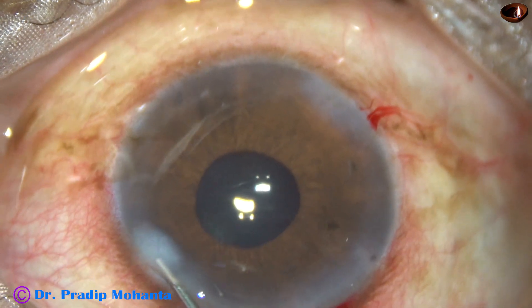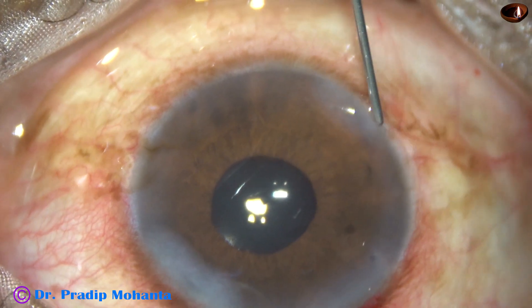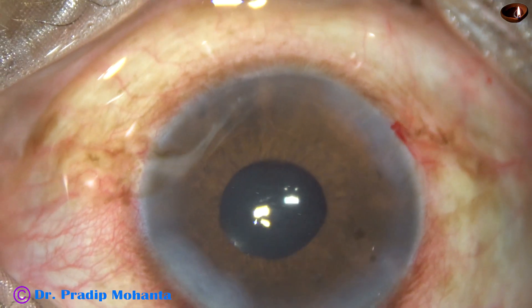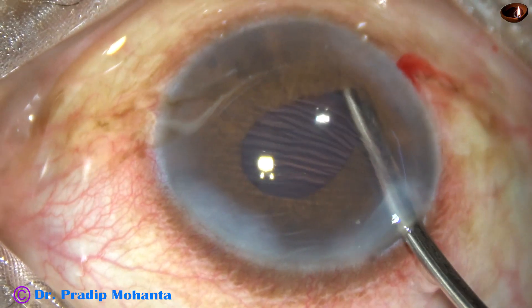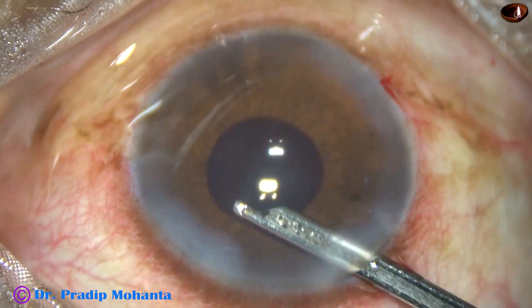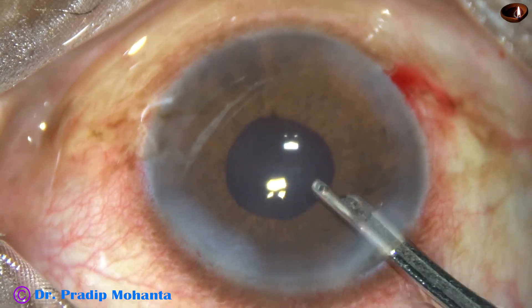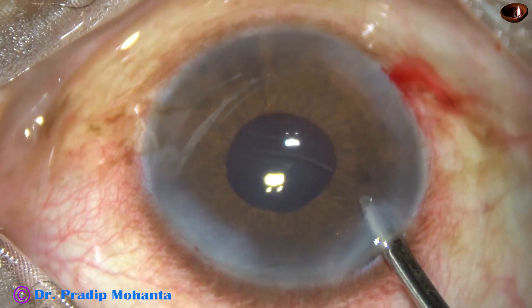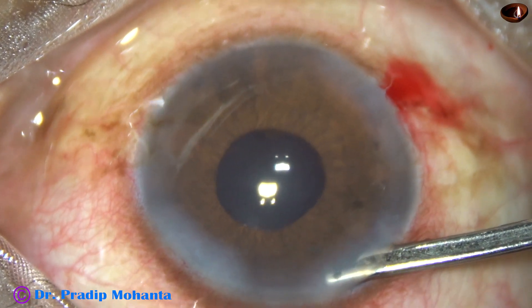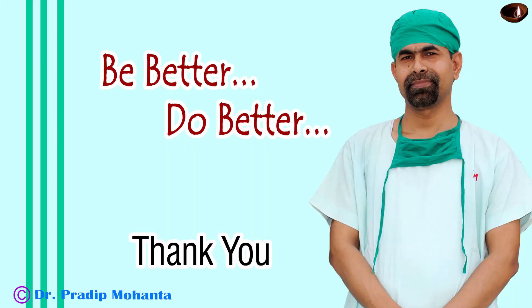These are the side ports at 8 o'clock and 2 o'clock. Now this is the final lavage of the anterior chamber. This patient did very well in the postoperative period — the intraocular pressure was controlled without any medication, and there was no flare or cells. This is formation of the anterior chamber, and then the case is concluded. Thank you very much for your attention.